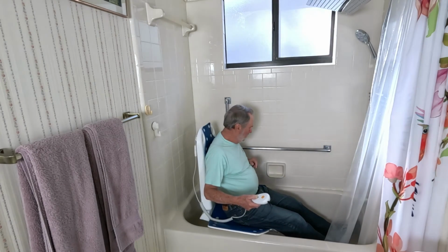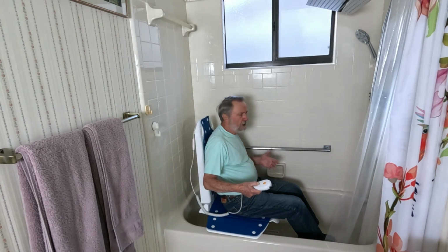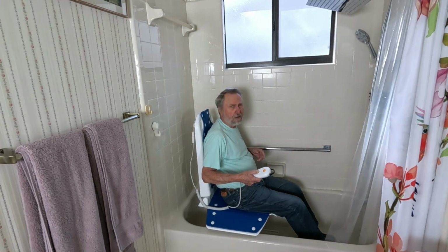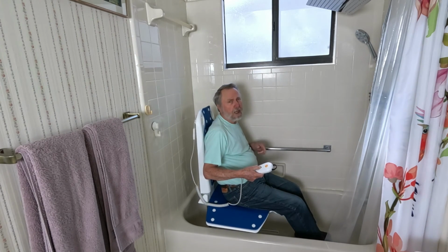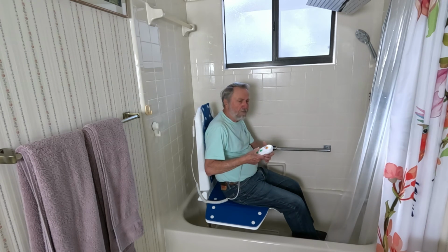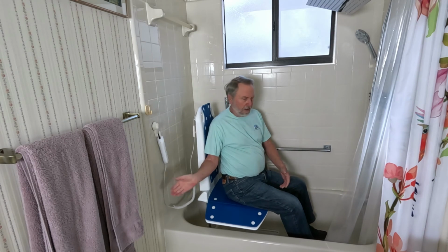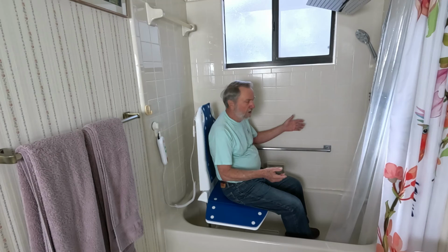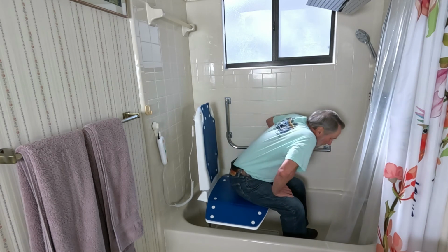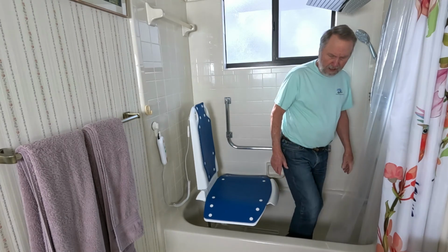Something to look at when you're placing it in the tub. And you need to measure the tub. There's instructions in the instruction booklet that explains that about using this in a tub. I stop, and I'm ready to exit the bathtub. So now I've completed my bath, and now with my rails I can push myself up and exit the bathtub.